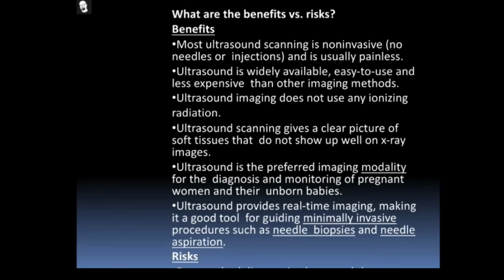Most importantly, this is the point: everybody goes for ultrasound. Ultrasound is not expensive, it is very cheap compared with CT, X-ray, and MRI. That is what I'm mentioning about CT, X-ray, and MRI. Ultrasound imaging does not use any ionizing radiation. That is another advantage. Everybody goes for ultrasound.